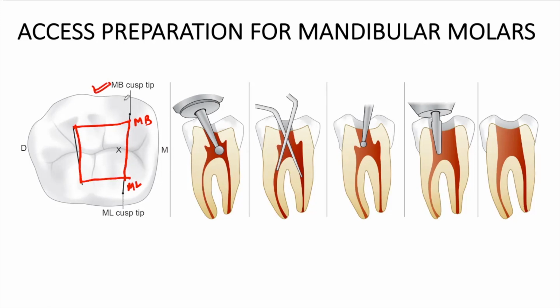Now how do we achieve this? Again, similar to other molars, the entry to the pulp chamber is made with the number 4 round burr in the central fossa. And again, once we gain entry into the chamber, we explore the canals using the Endodontic Explorer. Then we de-roof the chamber using the round burr, moving it in direction inside to outside. And then we remove dentinal obstructions using the safe tip tapered burr or Gates Glidden. And this is how we achieve the straight line access to the apical foramina.